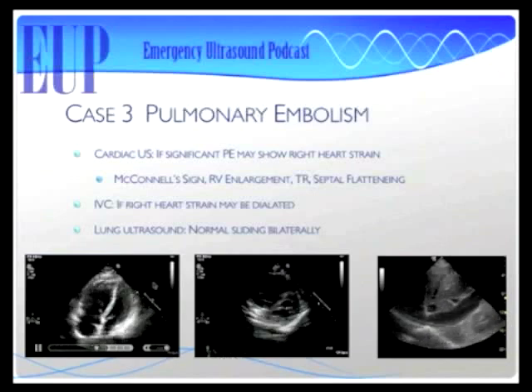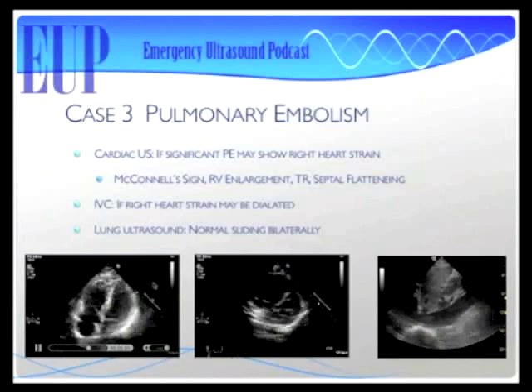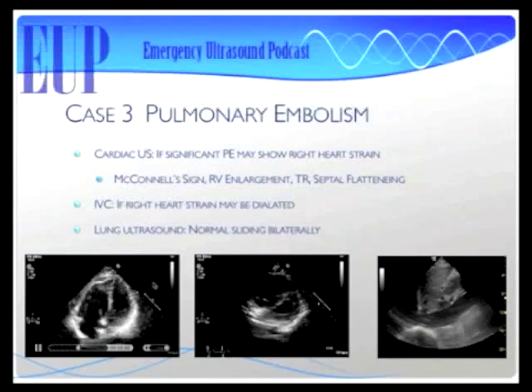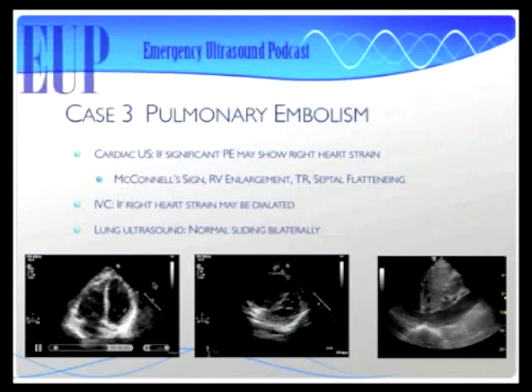So that's where it becomes important for me, because with pulmonary embolus, what do we really do? We don't do that much anyway. You anticoagulate them, unless of course they're so bad that they need lytics, and in that case we do a lot, right? We make a life-changing decision. And if this is a patient that's crashing, this is not someone who we can send to the CT scanner for a PE exam, right? Yeah, of course not. So that's when the echo becomes important.